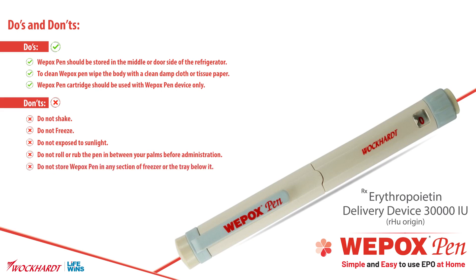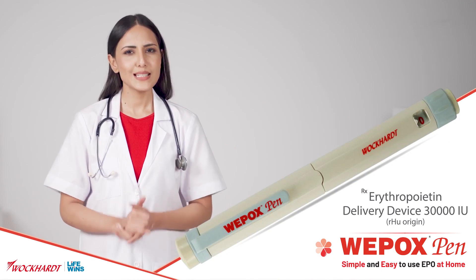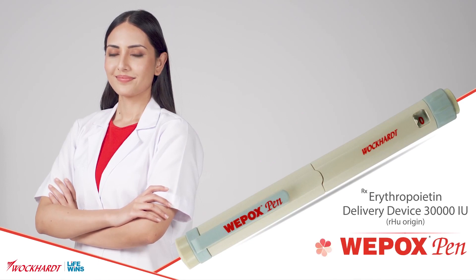Do not store Vipox Pen in any section of the freezer or the tray below it. To clean the pen, do not immerse it in water and do not use any solution that contains alcohol, iodine, or any detergent. Thank you for choosing Vipox Pen — simple and easy to use EPO at home.